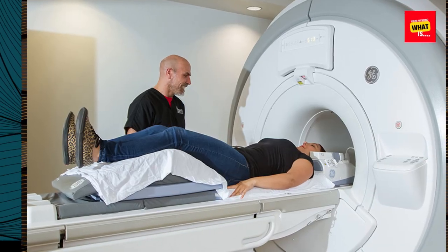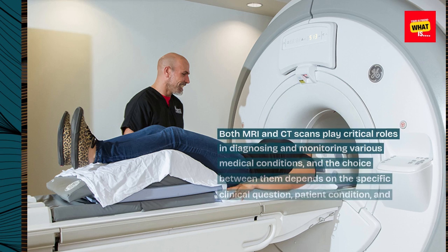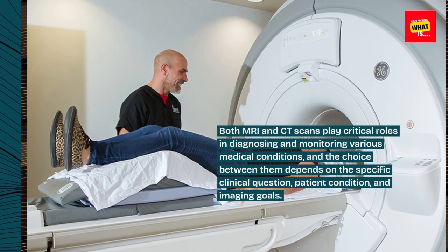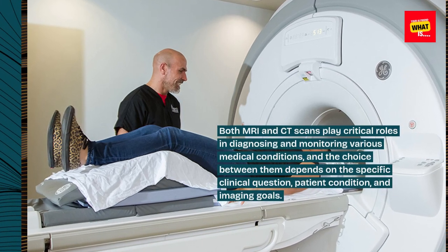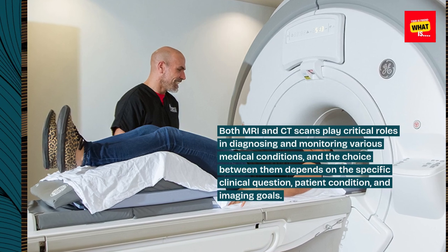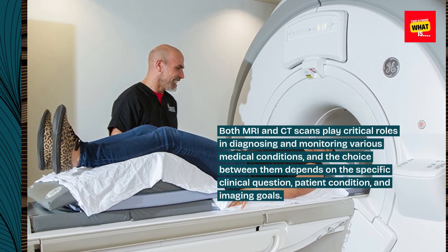Both MRI and CT scans play critical roles in diagnosing and monitoring various medical conditions, and the choice between them depends on the specific clinical question, patient condition, and imaging goals.